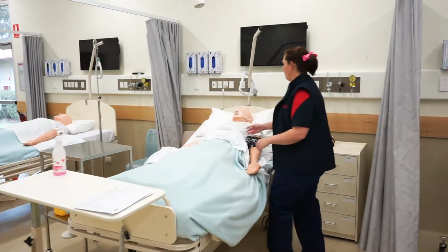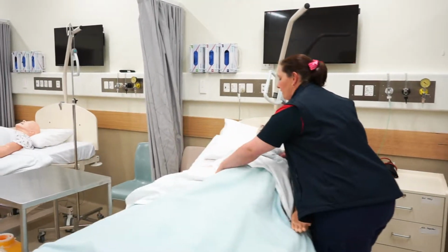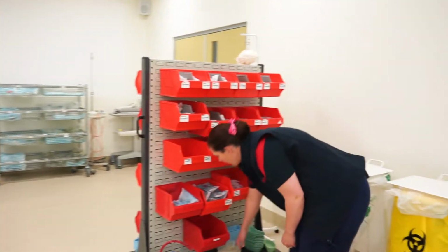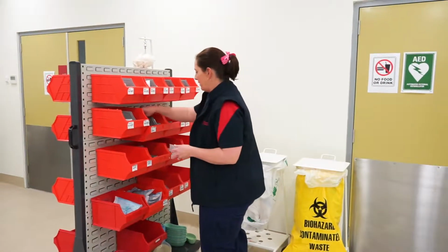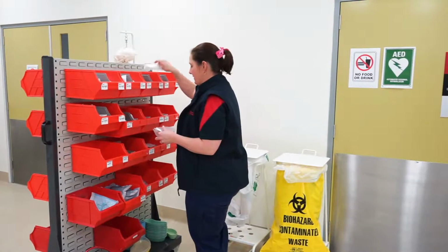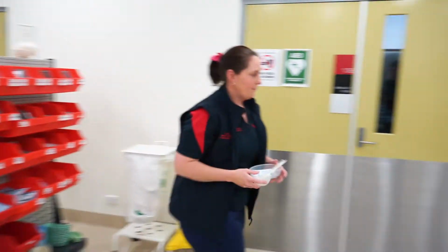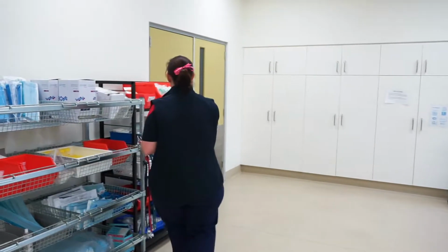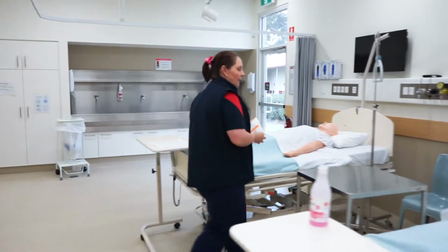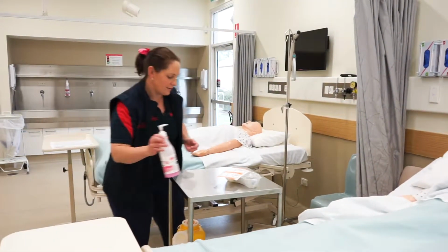So I'm looking after a palliative care patient who's just receiving some end-of-life care. And I'm just going to insert a subcutaneous line into the patient's abdomen. Are you in your second year too? Yeah, I'm also a second year student, although it's only my first year of studying here on campus. How does that work? Well, I actually came through university as an enrolled nurse, so it's a pathway into university. So you studied enrolled nursing and then switched across? I did study enrolled nursing, so I'm currently an enrolled nurse, and then that gives you the credits for your first year subjects, and then you just come straight into your second year.